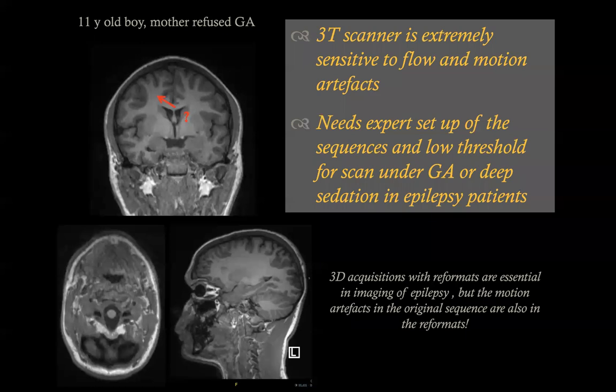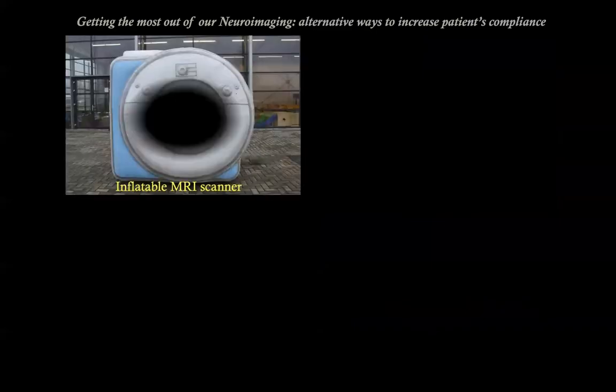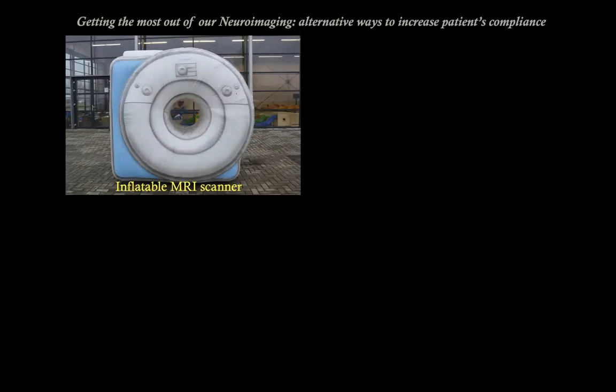But in order to look for a very, very subtle focal cortical dysplasia, this will be not appropriate.